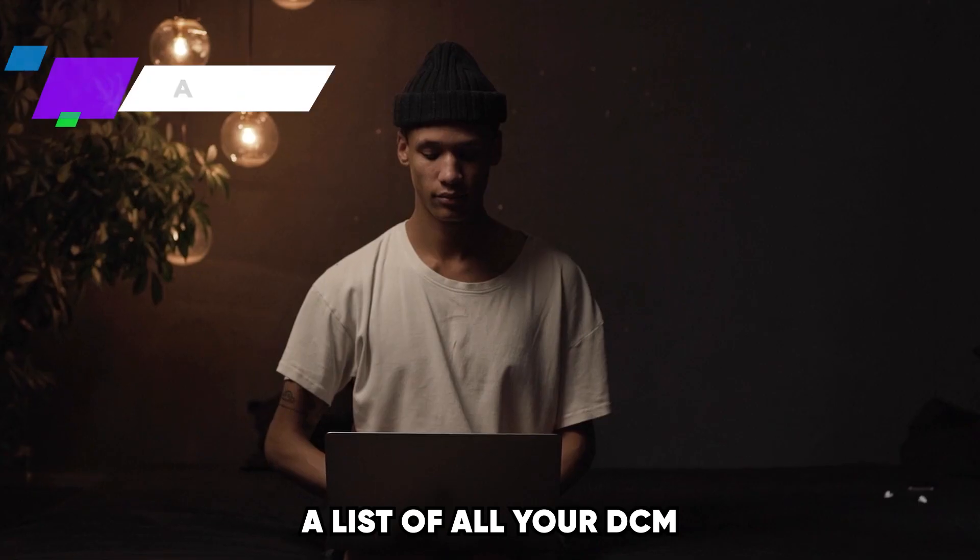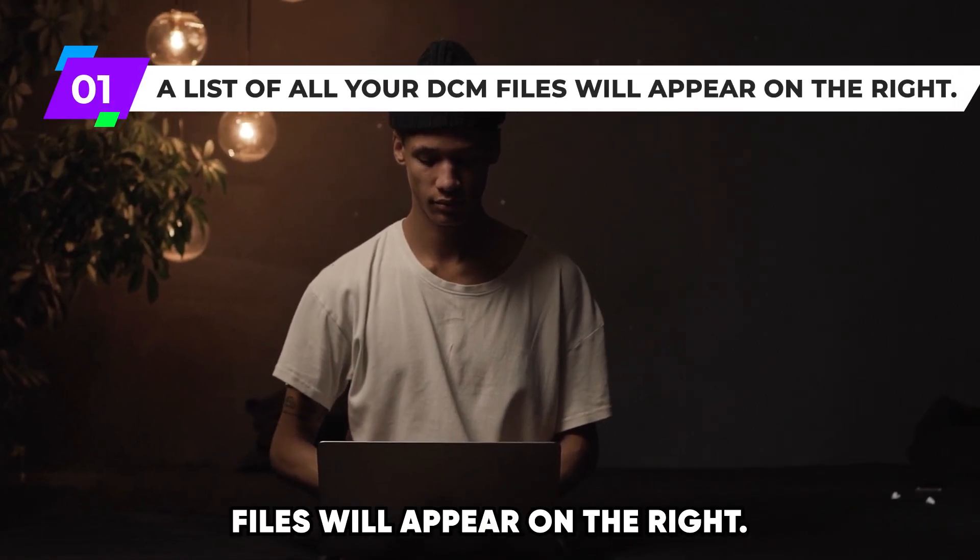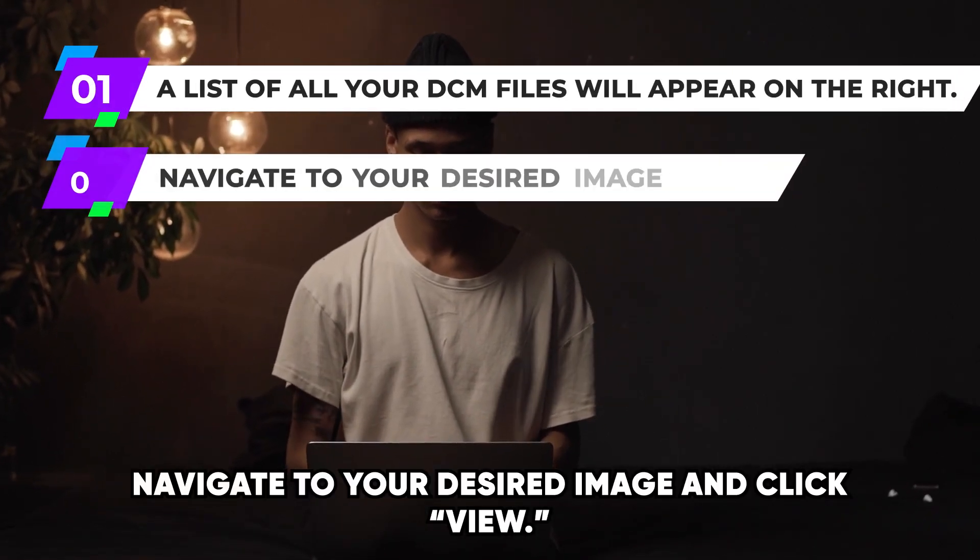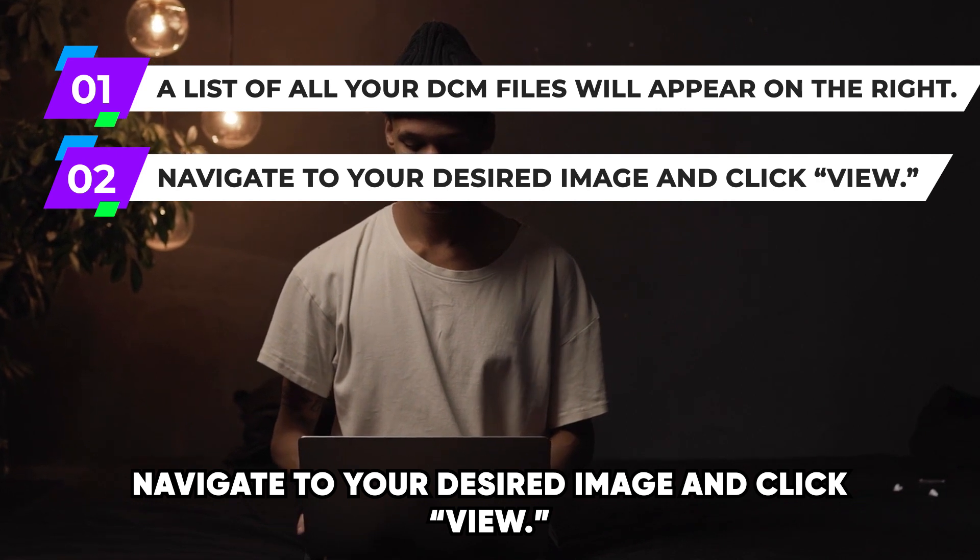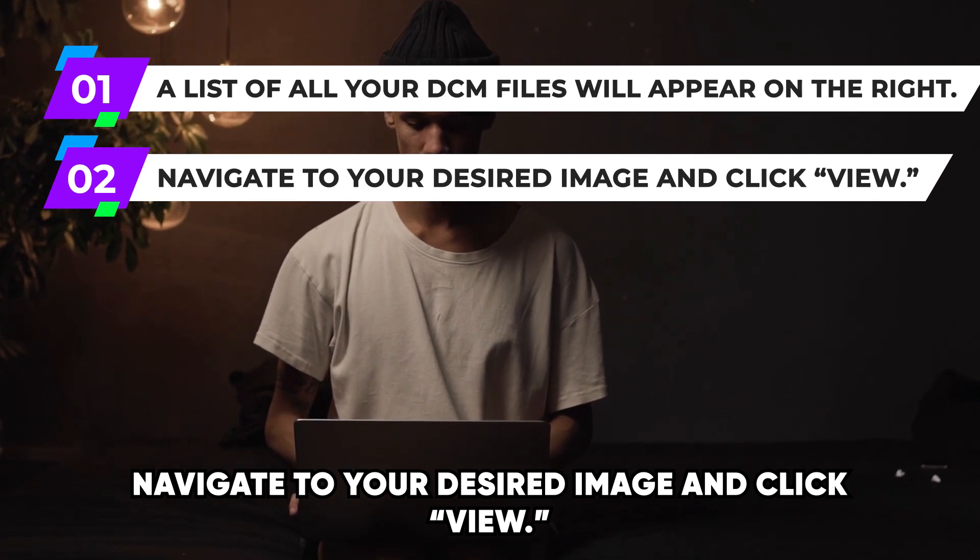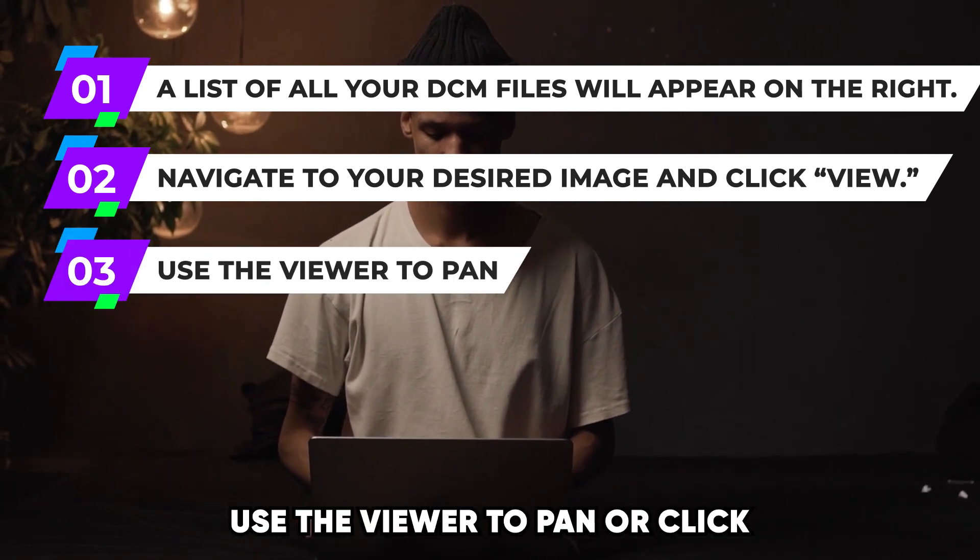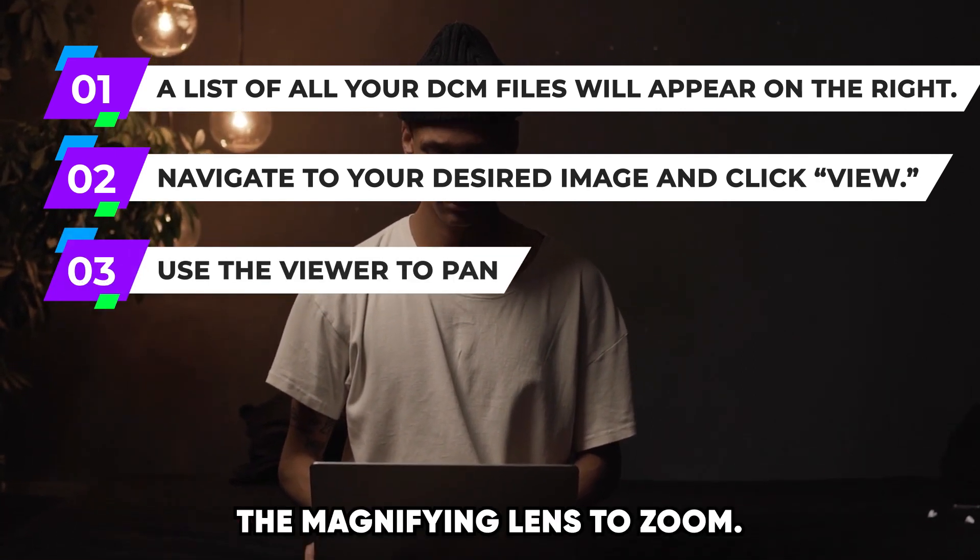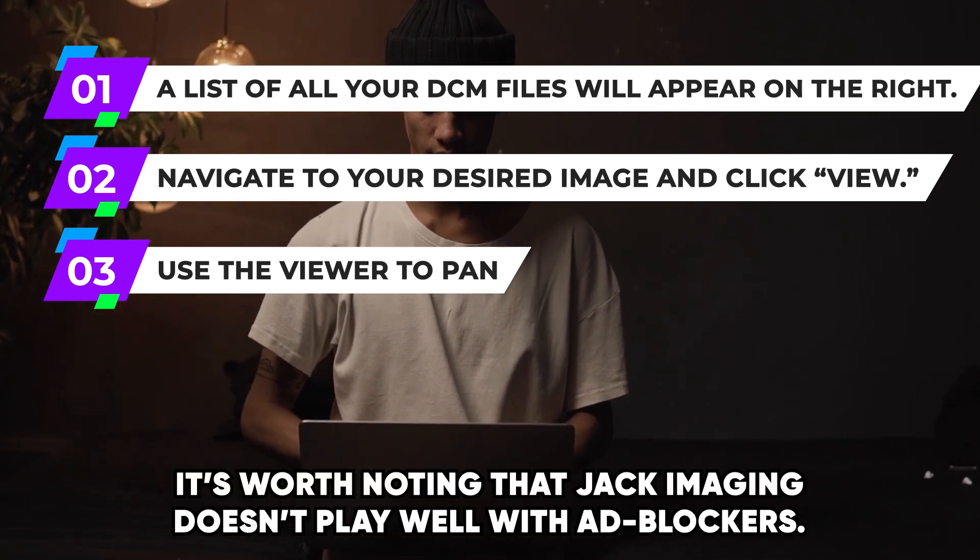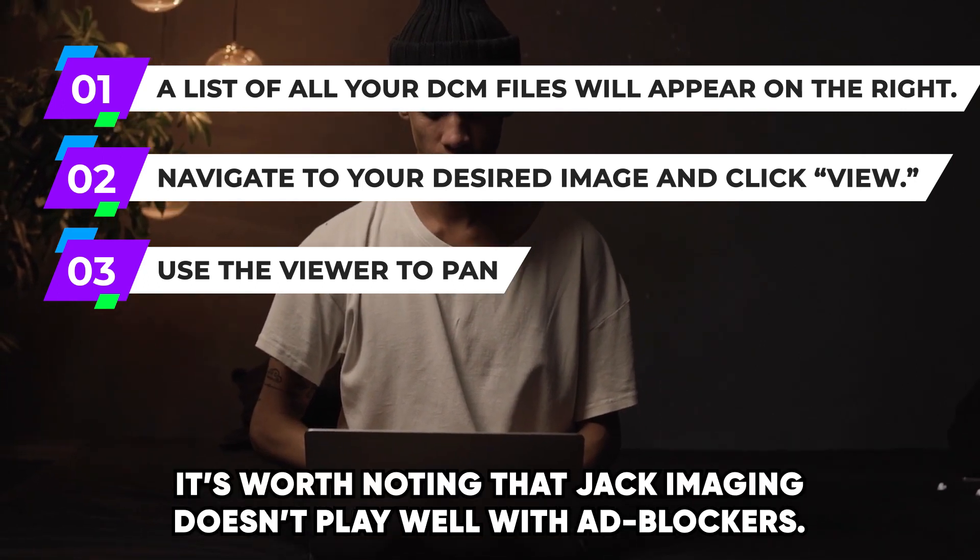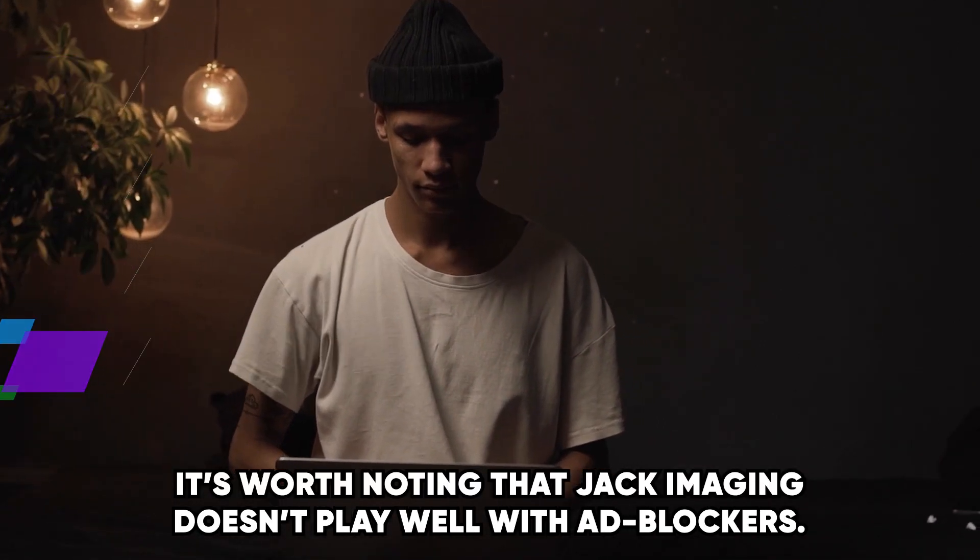A list of all your DCM files will appear on the right. Navigate to your desired image and click View. Use the viewer to pan or click the magnifying lens to zoom. Once you're satisfied, close the viewer.